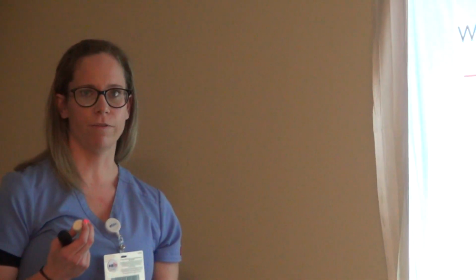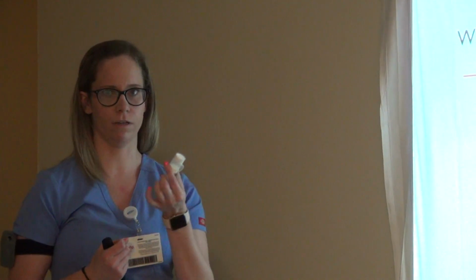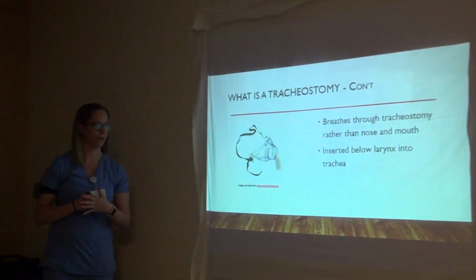We also have HMEs, which is like a portable trach collar. Basically it cleans and moistens the air. With an HME, if patients have a lot of secretions, they can cause their own mucus plug because they're not coughing this off typically unless they have a very strong cough. So we don't normally leave patients by themselves on an HME.